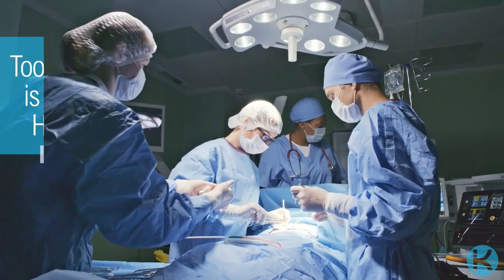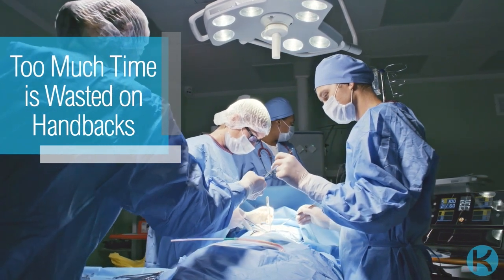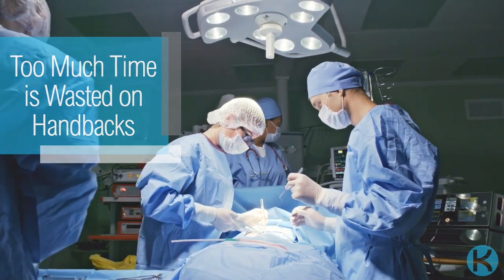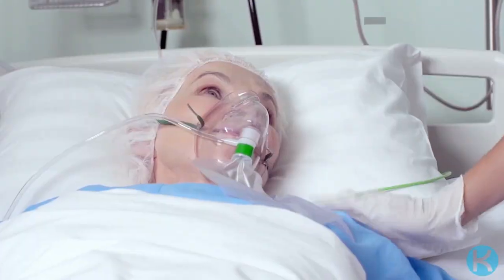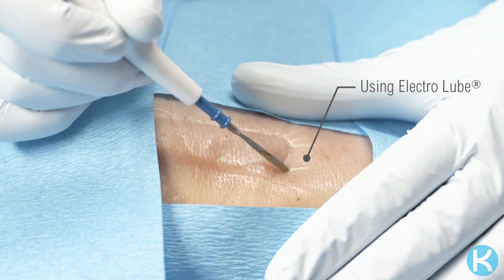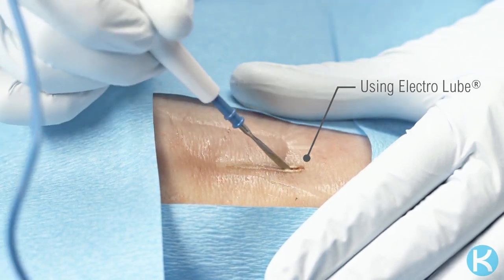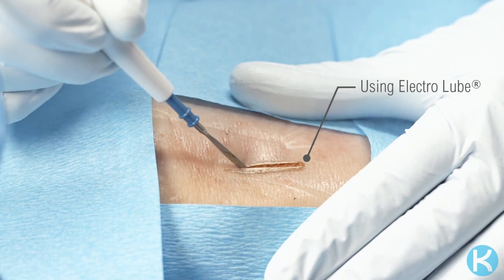Too much time in electrosurgical procedures is wasted on handbacks, unnecessarily increasing the time the patient is on the OR table. We understand that every minute counts in the OR, which is why we have developed a solution to help improve the way your electrosurgical instrumentation performs during surgery.